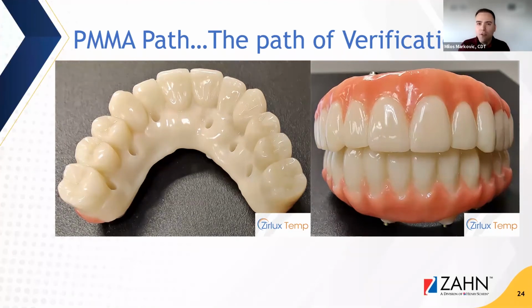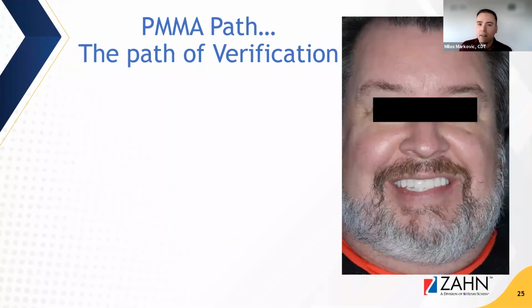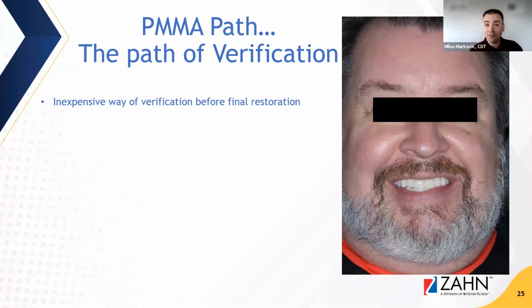I don't jump straight to finishing the case without enough data. I want to have as much data as I possibly can. So I use PMMA as that tool. In this case, for this patient, we had many different markers that we try to verify with the PMMA restoration. And I find it's a very inexpensive way before final restoration.